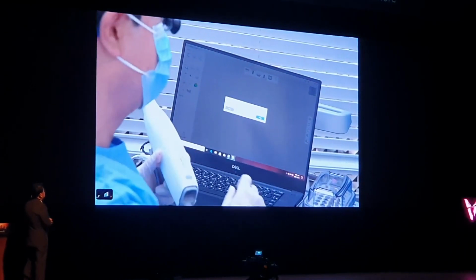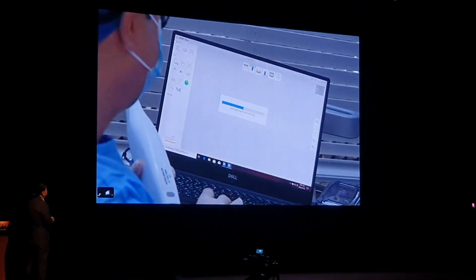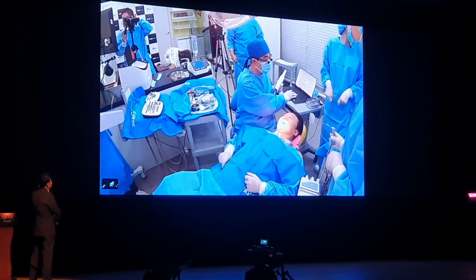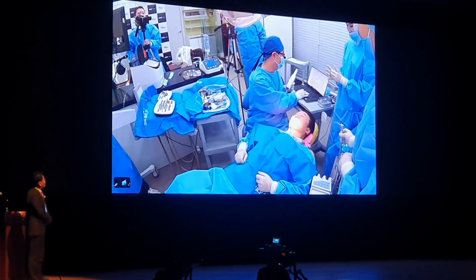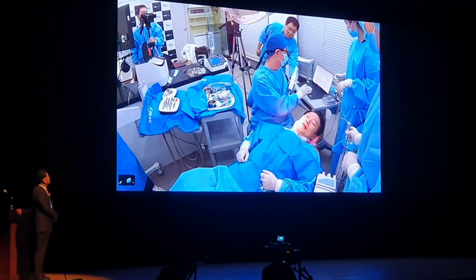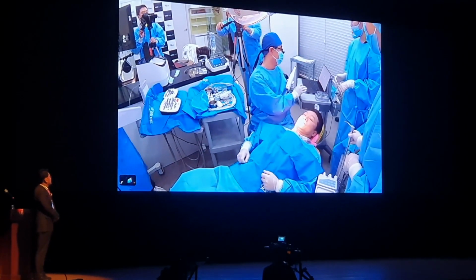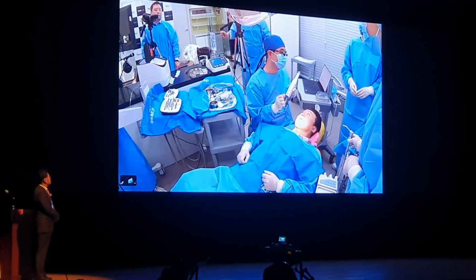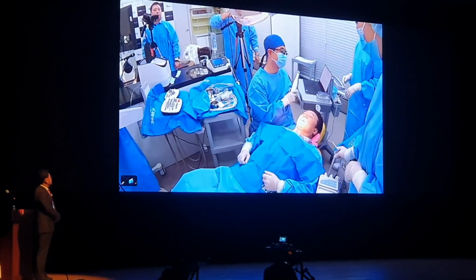So the result is very good. Actually, it would be nice if the patient comes in and places the implant by himself. So it could be very convenient for the surgeon. I didn't know that Dr. Ho had this many gold crowns in the mandible. All of them.